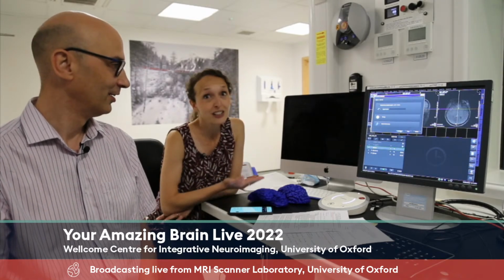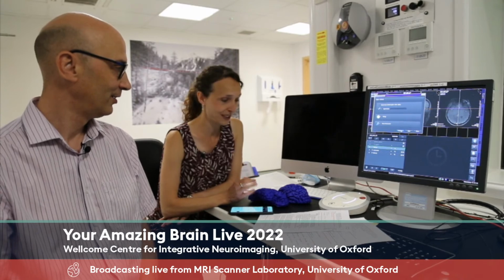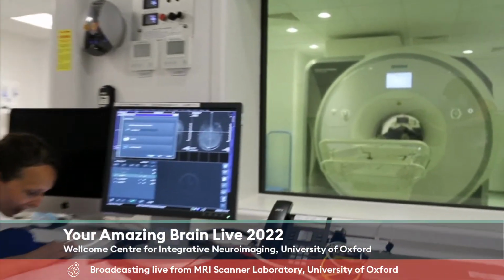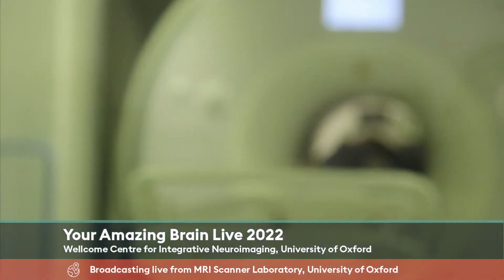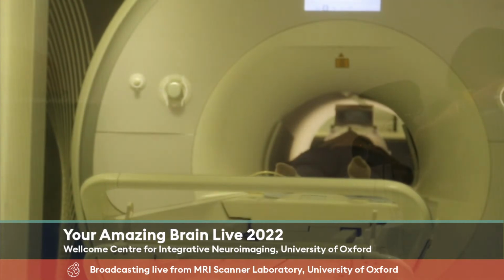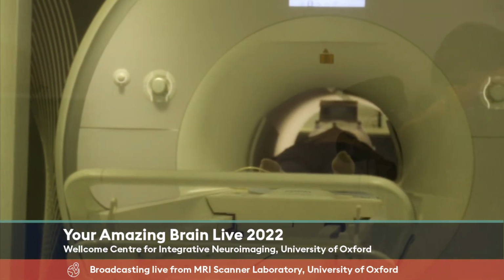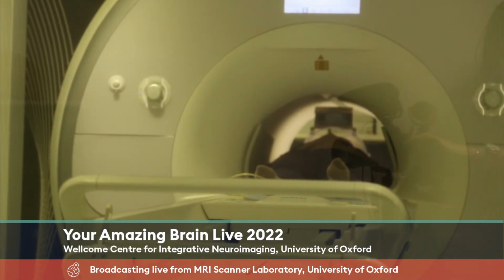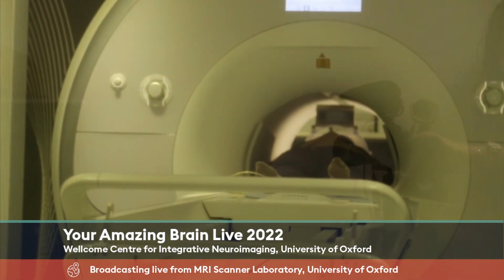That's something we actually do when we run experiments, to make sure our participants are happy. So I will just talk to Barbara. Barbara, can you hear me? Yeah, I can hear you. Perfect. Are you doing okay in the scanner there? Yeah, I'm good. Can you just confirm that you are really scared of octopuses for the children who are listening? Yeah, I hate them. I hate octopuses.